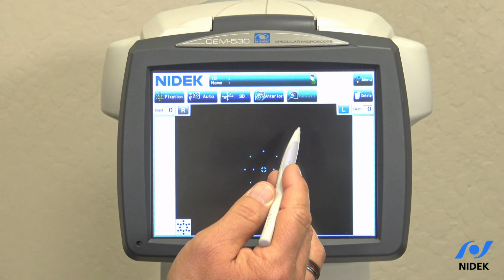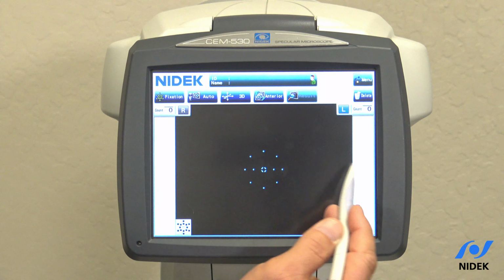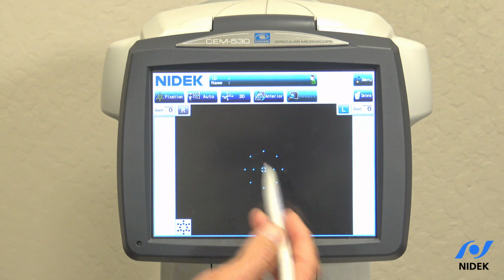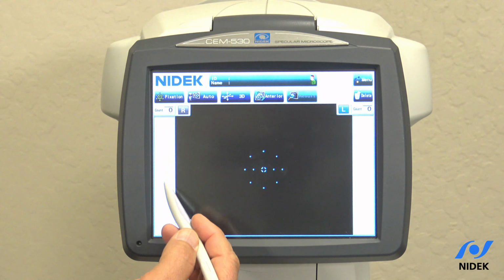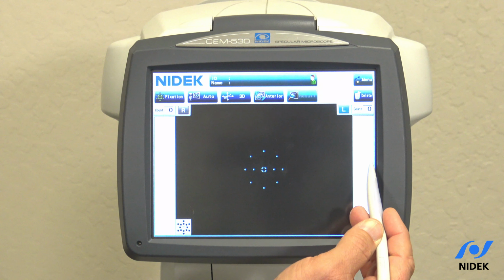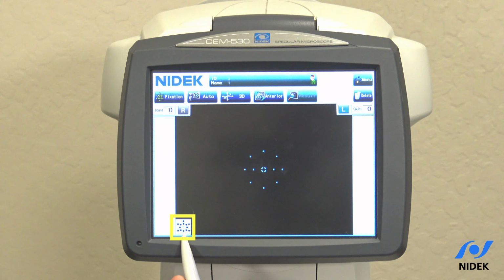And your results tab. To delete the patient data, you would click on the delete tab. The count tells you how many images are taken on the right and how many images have been taken on the left. This display down here tells you the area that we're going to be capturing. If you select multiple areas, those areas will end up pink until they are completely taken.